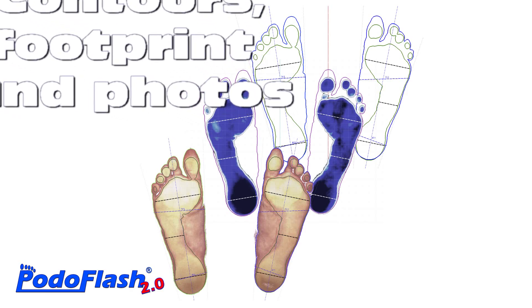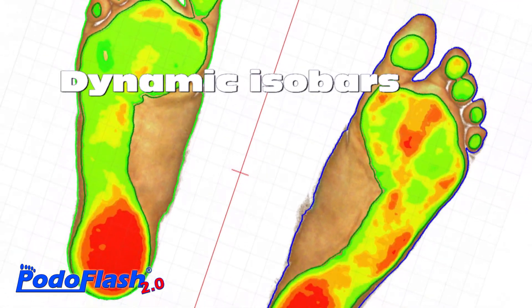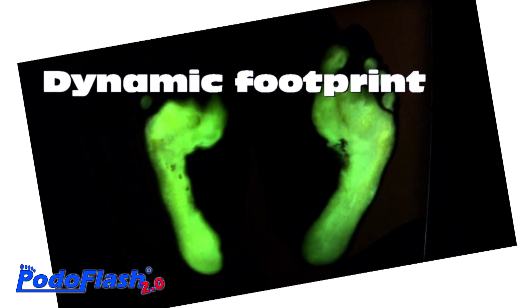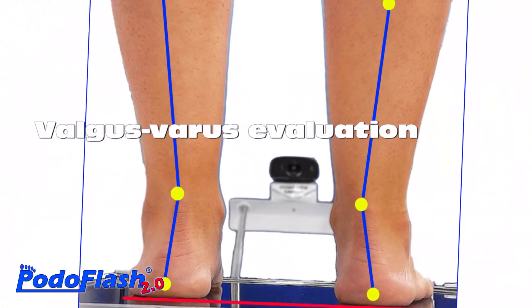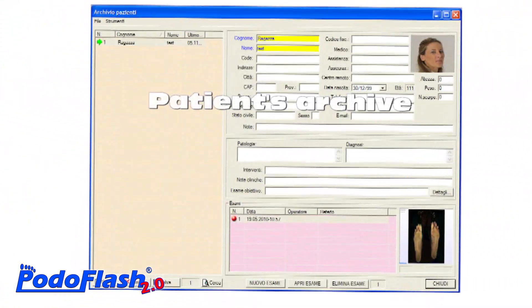In addition to the accurate foot measurement, the software performs a qualitative and dynamic assessment of the footprint using pressure isobars, and also offers the possibility of importing pressure maps to assess plantar pressure and posture, highlighting areas with greater postural loads. The software supplied with the device is very advanced and at the same time easy to use.